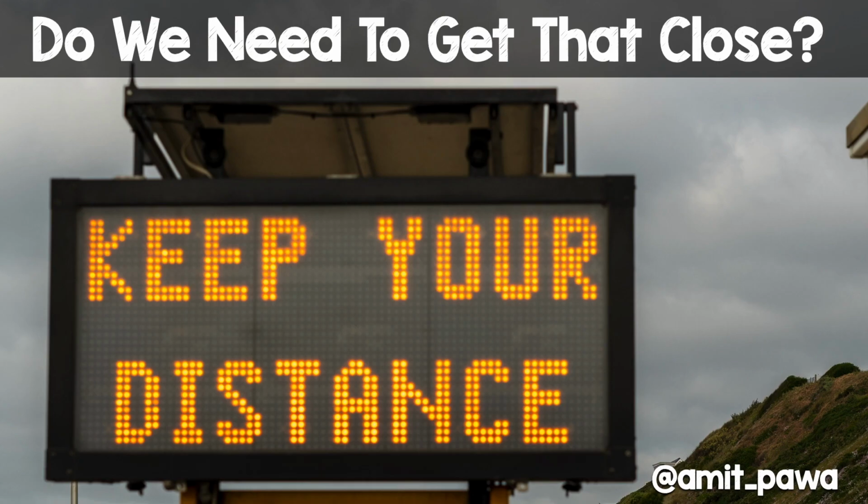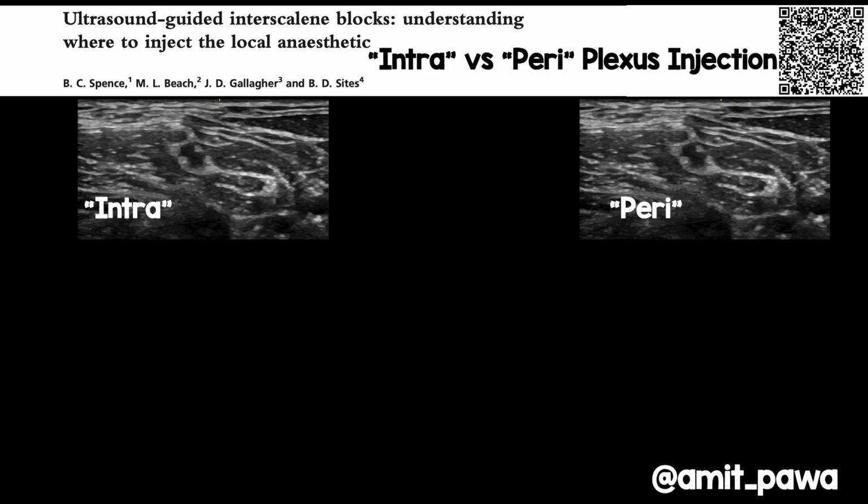So the real question is, do we need to get that close? Even though we can see how close we are with ultrasound, maybe we can achieve success by being a little bit further back. The best example I've got of this is this paper, which definitely changed my practice and introduced that whole concept of intraplexus injections for interscalene block versus periplexus injection.